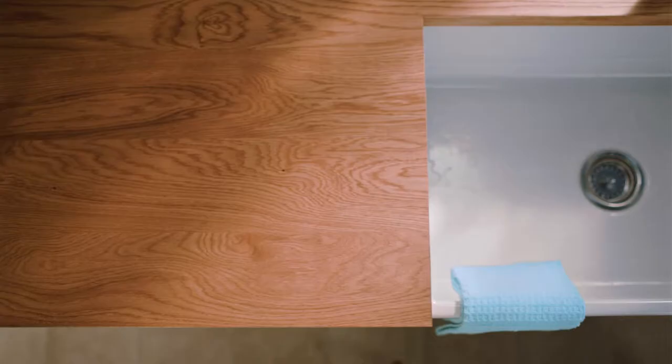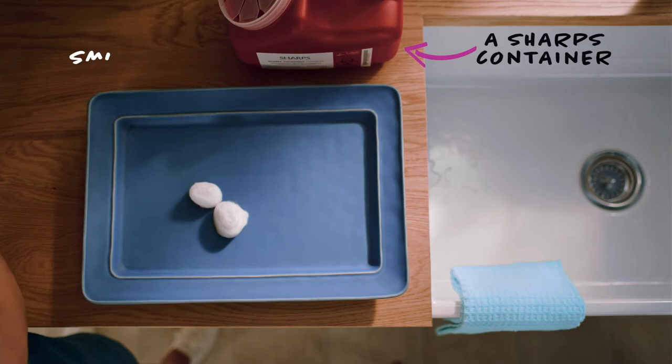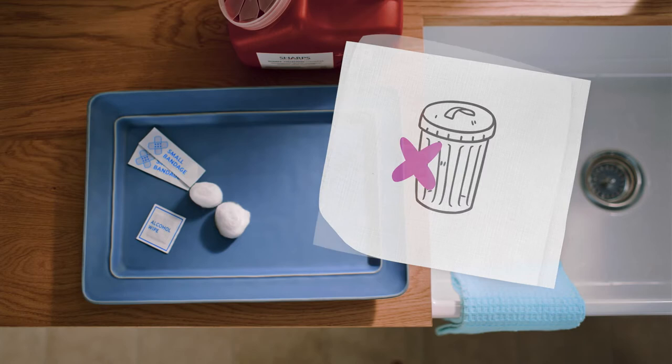Before getting everything together, you'll want to have a clean surface for your materials. Here's what you'll need: a nearby sink to wash your hands, clean gauze pads or cotton balls, a sharps container, small bandages, and an alcohol wipe. If you don't already have a sharps container, you can get a free one by calling the ADBRI Advocate Program. Don't throw syringes or syringe covers away in a regular trash can. For now, you can use an upright household container, such as a coffee can or an empty laundry detergent container.